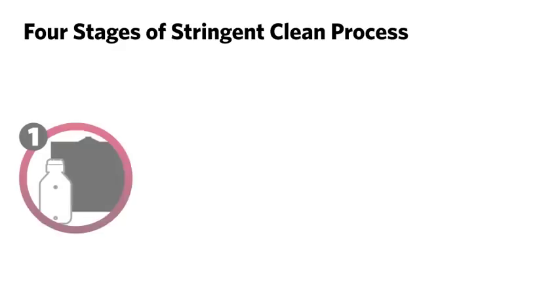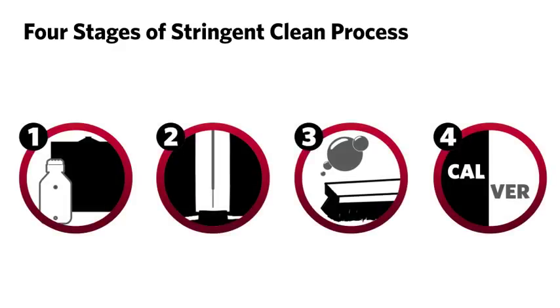The stringent clean process consists of four stages that can solve various issues on the Luminex 200.